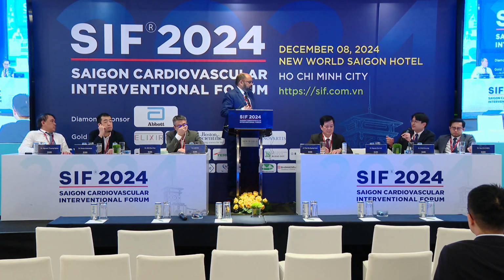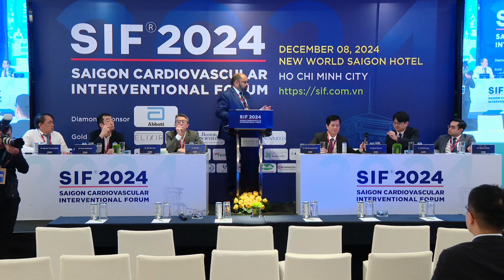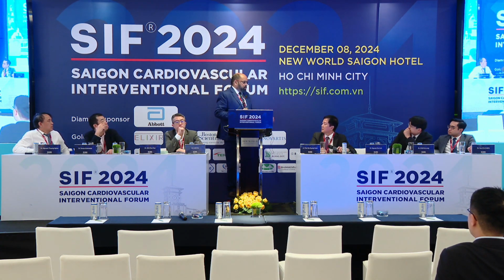If it's going to be a DCB, I do not always image after pre-dilatation. It just confuses you. I just go with angiogram. How about if you size according to imaging, do you size to the lumen or size to the vessel size? Lumen, absolutely. So with OCT, I go lumen to lumen. So it's a bit conservative. My colleague who uses IVUS more often is more aggressive. And I don't think you need to be that aggressive with DCBs. That's the beauty of it. With the stent, bigger the better. With DCB, you don't need to be that aggressive, and it seems to work well.